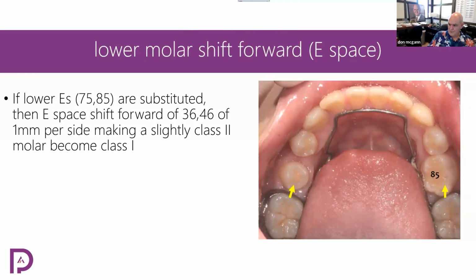Okay? If you were going to put an aligner on top of this right now, instead of the lower lingual arch, you decide you wanted to put an aligner. So you didn't have to fit the bands. You didn't have to do the lingual bar. You didn't have to deal with it breaking or anything else, okay? And you decide that you wanted to put an aligner over this right now, with the idea that you're not going to pay $1,000 for a set of aligners just for this. No, you're going to get an unlimited package that's going to take you through phase 1, phase 2, all the way to the end, okay? You're not going to do this case with brackets. You're going to do it with aligners, okay? So you decide, I prefer doing that, boom.